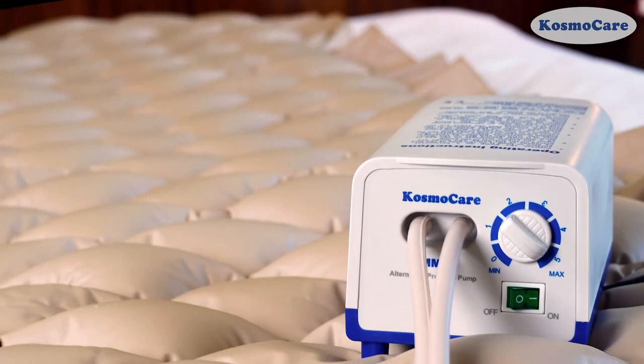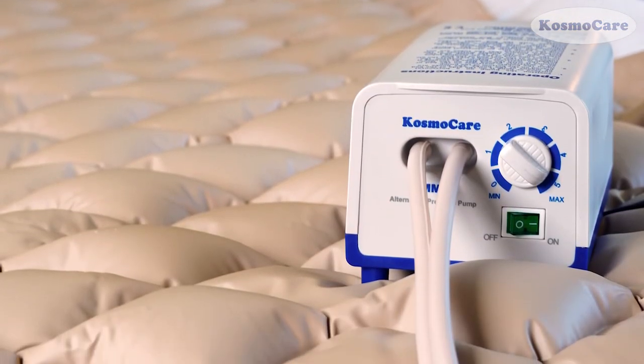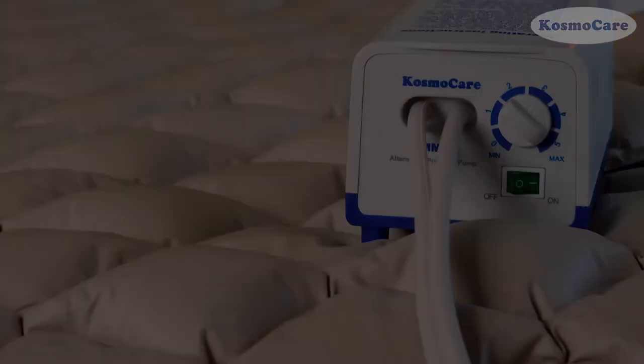Give your loved ones the comfort and relief with the Anti-Decubitus Bubble Air Mattress MM2 from CosmoCare.